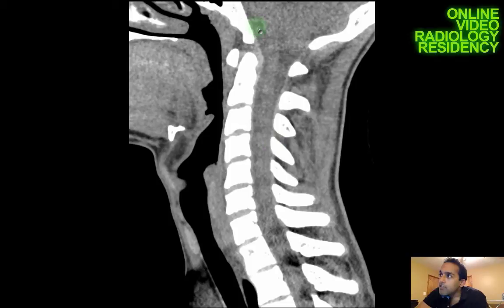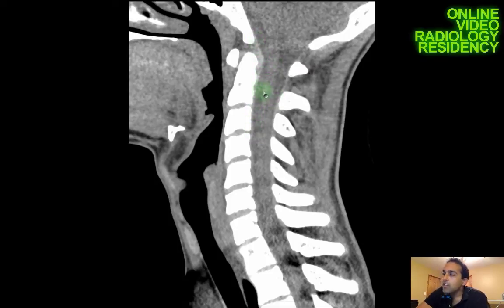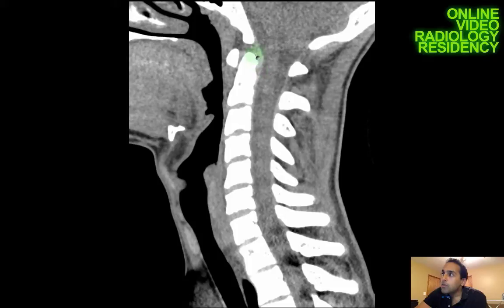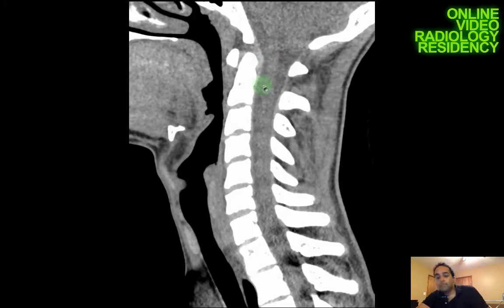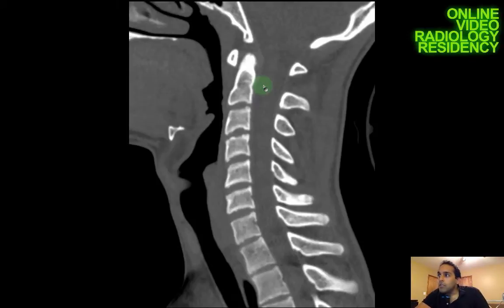In the midline sagittal plane on soft tissue windows, I can faintly see the CSF of the cervical spine — the cord is here, and the CSF is anteriorly and posteriorly. I'm looking for any epidural hematoma, which would appear as abnormal high density layering in this space. Importantly, I don't want to mistake the high density of the cranial-cervical ligament complex for pathology.